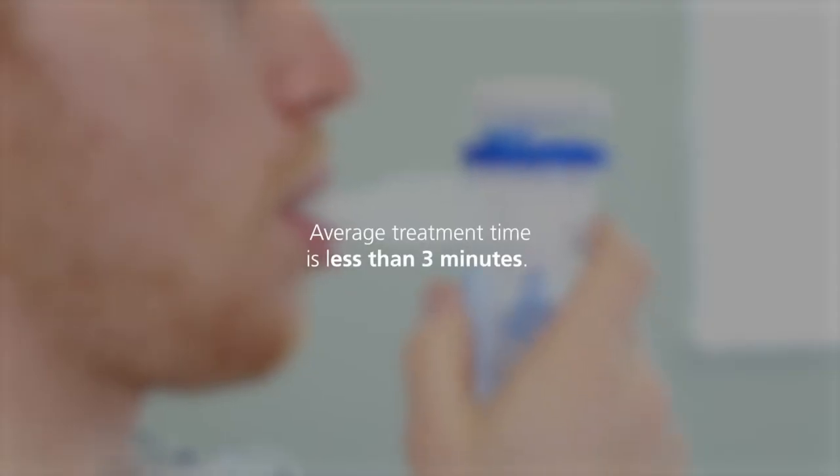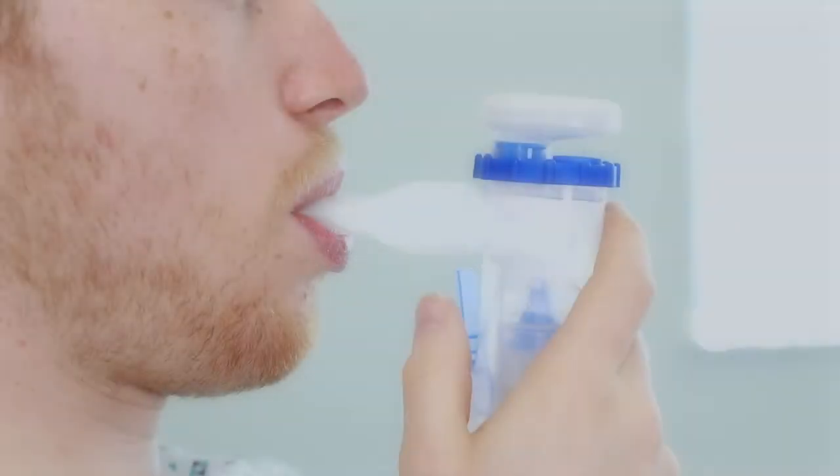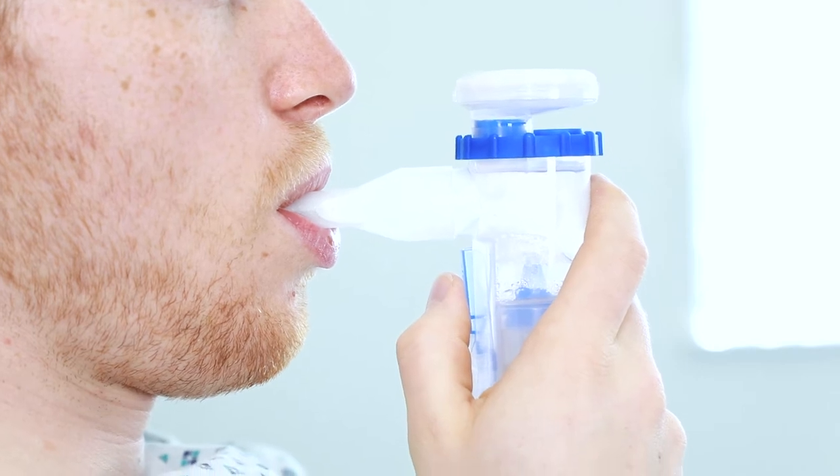Average treatment time with Maxineb Duo is less than three minutes. While breathing in, the trigger should be pressed.